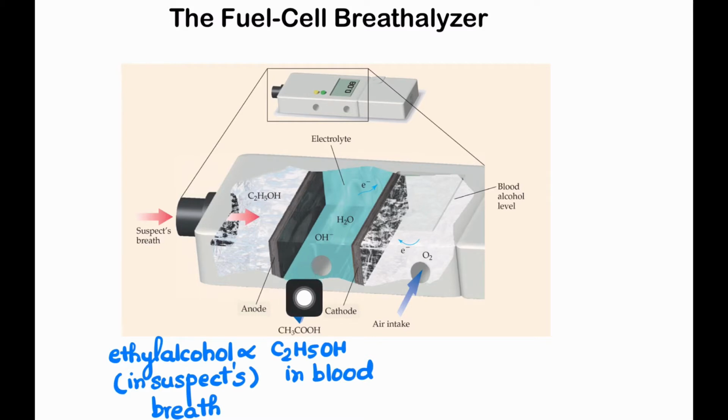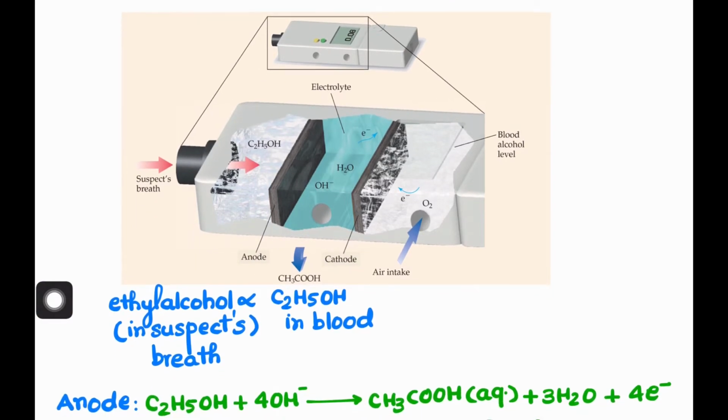So the anodic reaction that will take place is this one. The ethyl alcohol present in the suspect's breath will get oxidized to acetic acid at the anode.